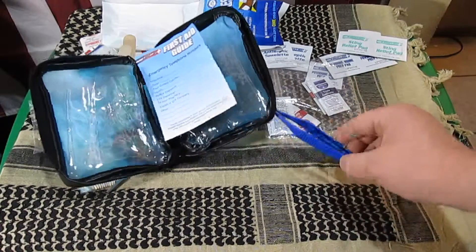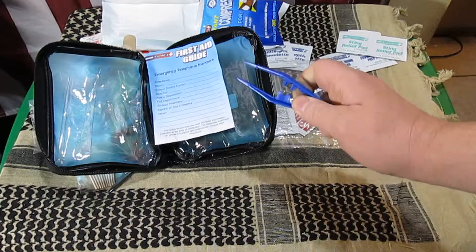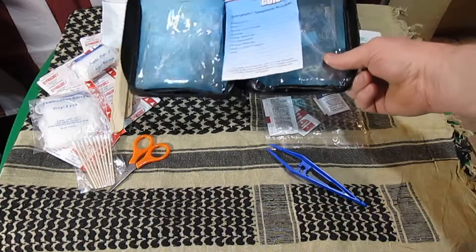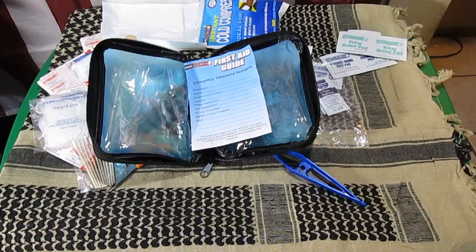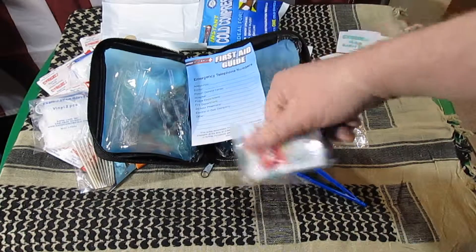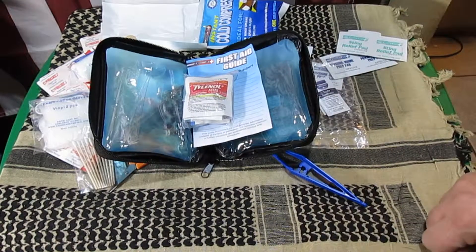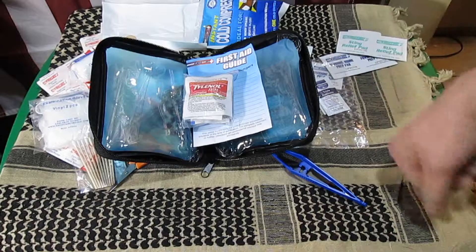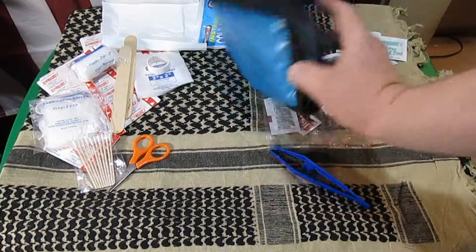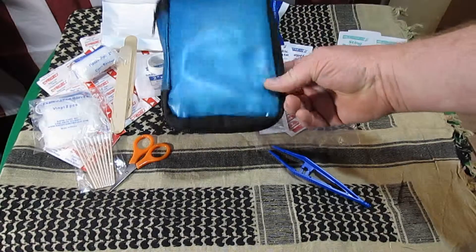Another thing I don't like about it: plastic tweezers. I'd rather just go get my own and get a pair of metal tweezers. And there's no medications in here. So I went ahead and threw together my own little pack, just various stuff that you'd find in most of your first aid kits. If you can find it for $10, I'd say grab it — it was a killer deal when I got it. At $20, there's probably better kits out there.